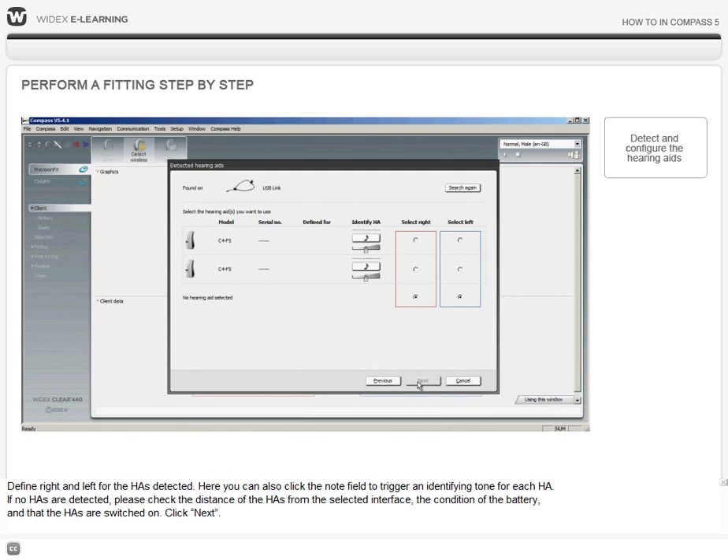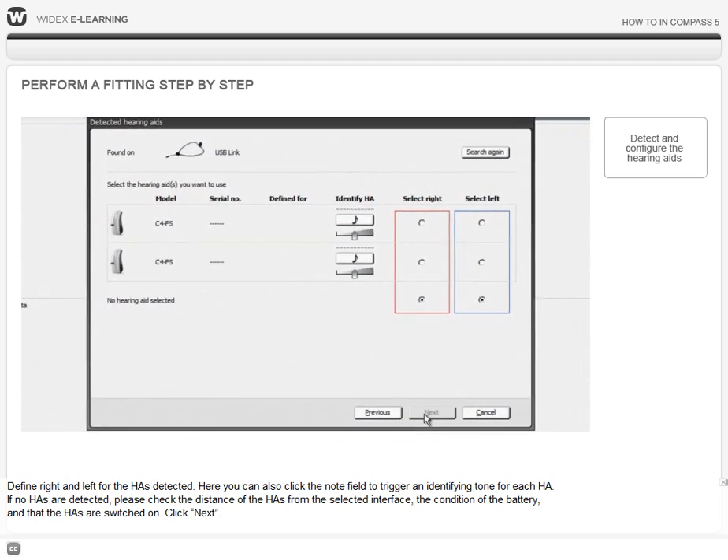Define Right and Left for the hearing aids detected. You can also click on the note field to trigger an identifying tone for each hearing aid. If no hearing aids are detected, please check the distance of the hearing aids from the selected interface, the condition of the battery, and that the hearing aids are switched on.